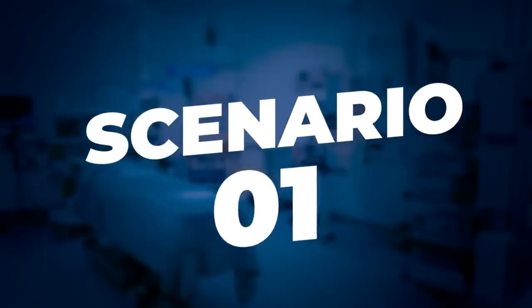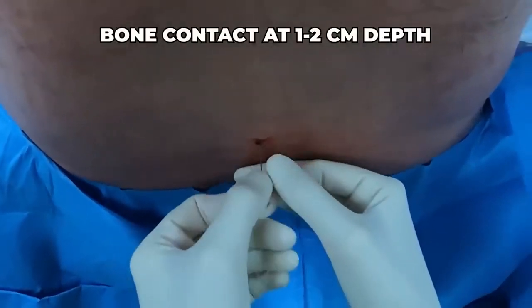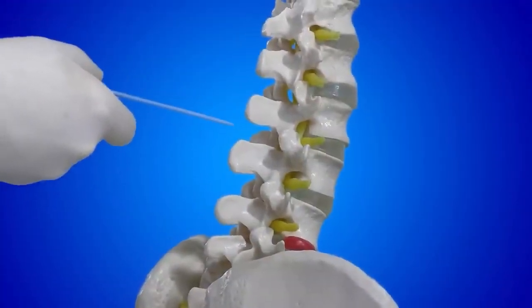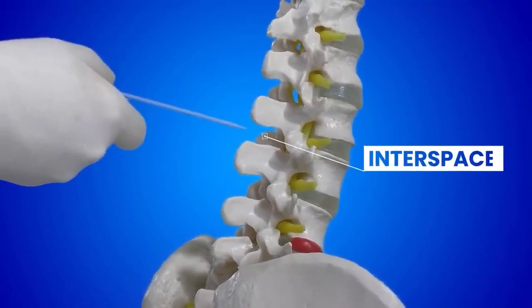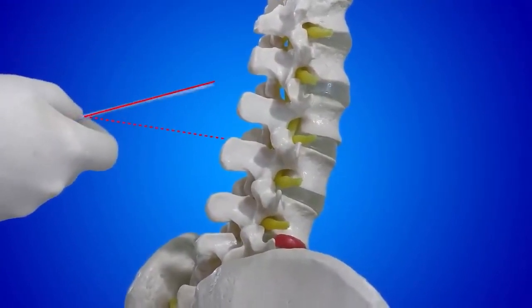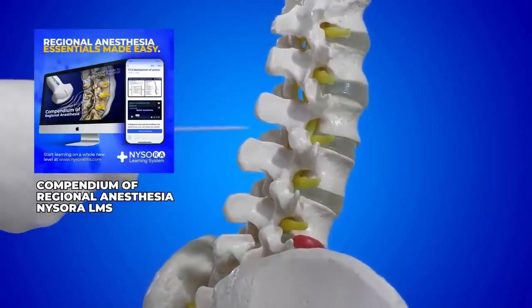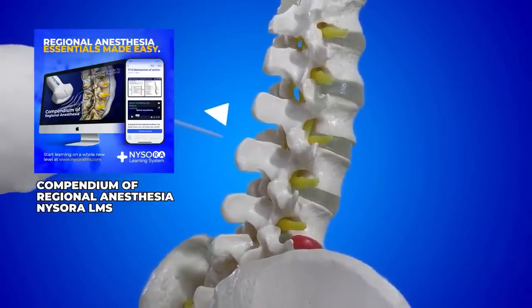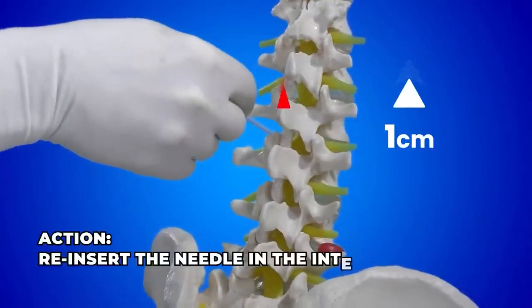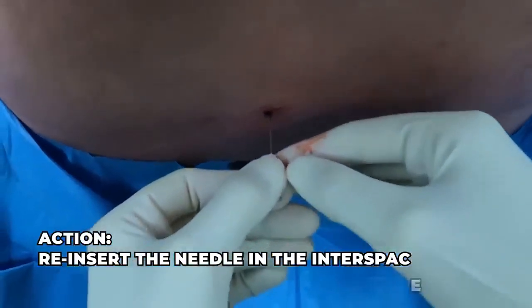Scenario number 1, the needle touches the bone superficially. When that happens, what that means is that we are in the midline, but not in the interspace. The course of action is take the needle out and do not reposition by reorienting cephalad or laterally. Rather, take the needle completely out of the skin and reinsert the needle 1 centimeter up or 1 centimeter down to place the needle in the interspace.